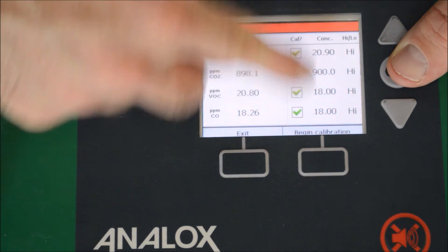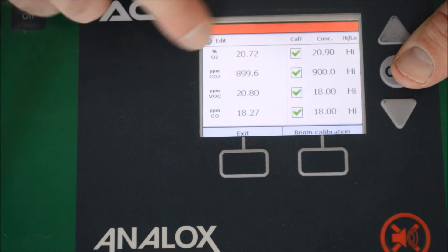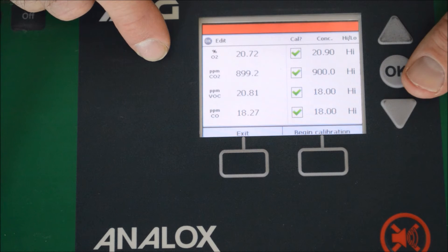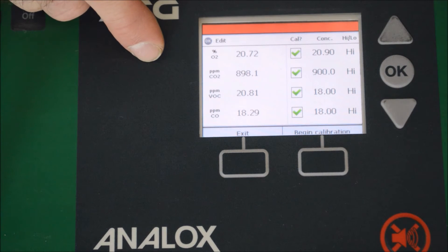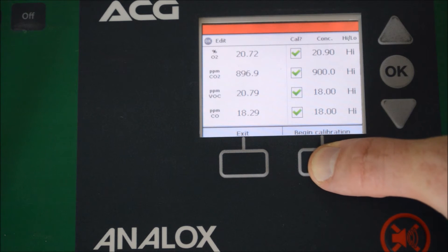We need to check that the calibration concentrations are the same as what we have on the bottle, and these, as we mentioned before, are our live gas readings. Because we've had it running for five minutes, it's stable, we can now continue with the calibration. So we need to press begin calibration.